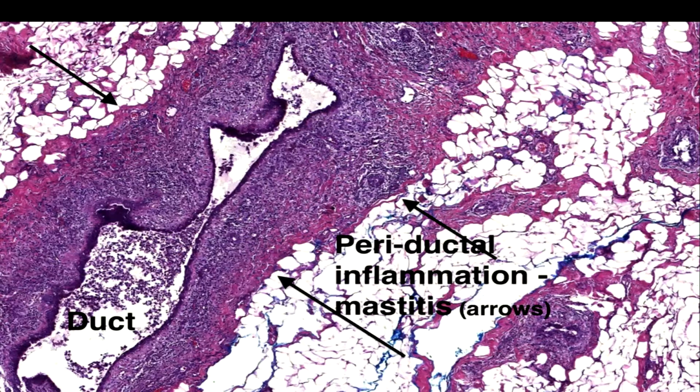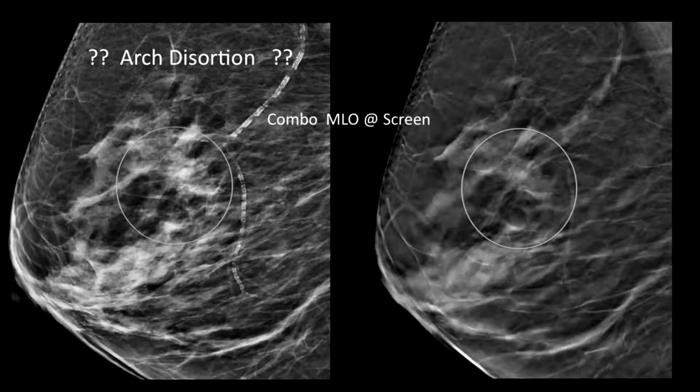And so we're getting that detail now with tomo that can make it quite challenging to figure out, is it real or is it just summation tissues? So I wanted to go through cases that were called back for architectural distortion that we ended up calling summation tissues. Because it's dandy to have a bunch of pictures here and say, oh, this is distortion, distortion, distortion. Okay, don't you get it? No, the hard part is to try to figure out when it's not, and that you feel comfortable in saying this is not architectural distortion. So let me try to go through and explain why it's not.